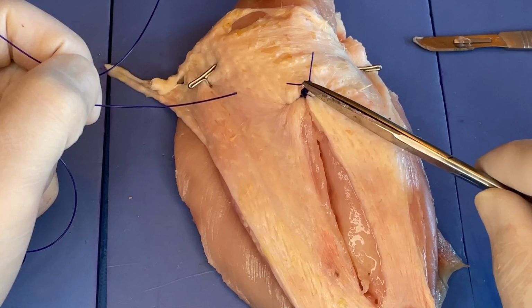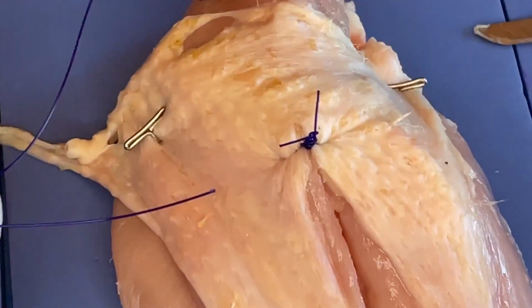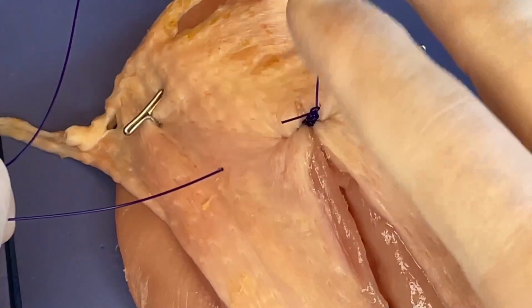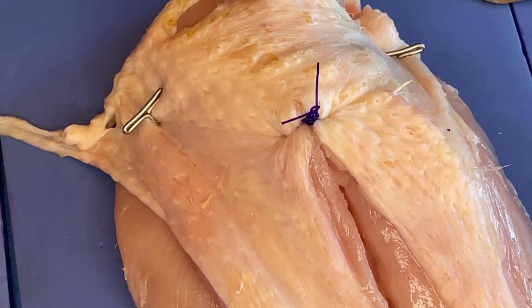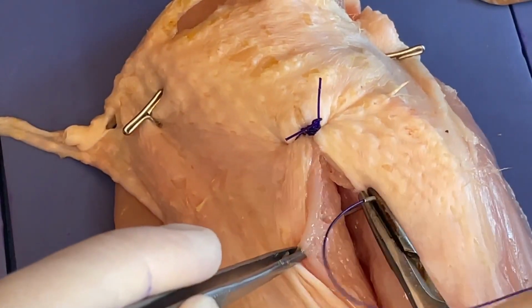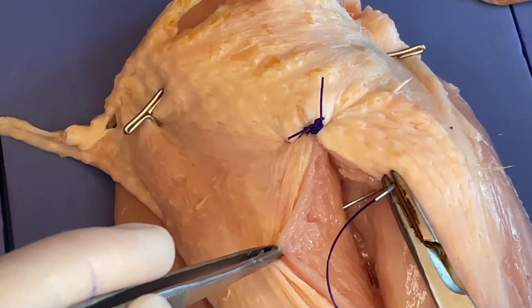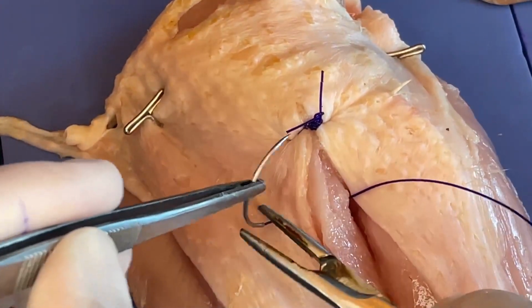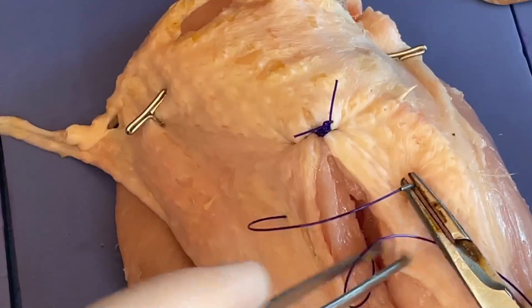So you can see that that leaves a lot of suture material in the knot itself. So when you're using this on fascia, if it's in a thin patient, these knots could actually be palpable through the skin. So one of the things you can do is try to bury them. So we can come down, and again, we talked about burying an interrupted, or just burying a knot, is starting down here in to out. And then out to in.